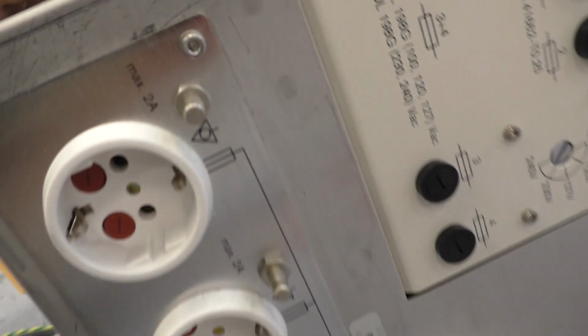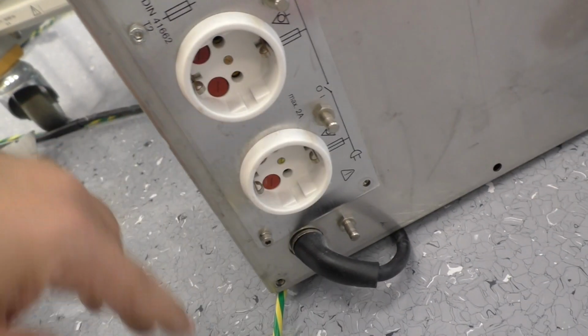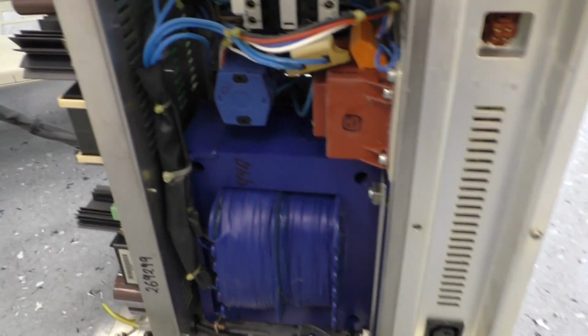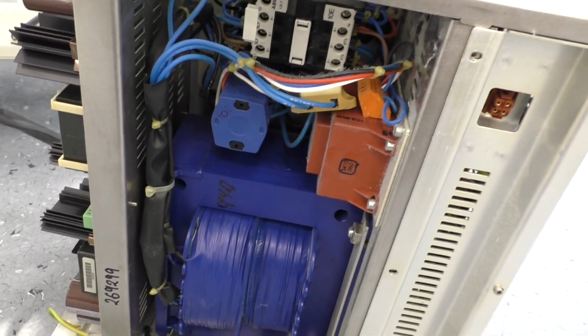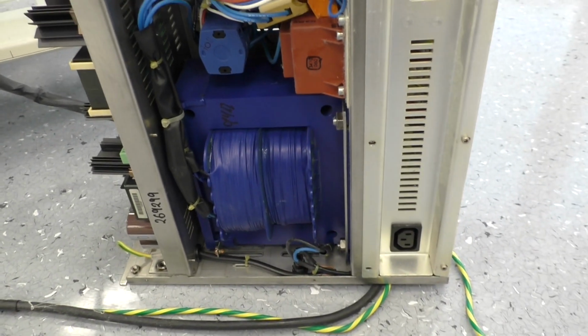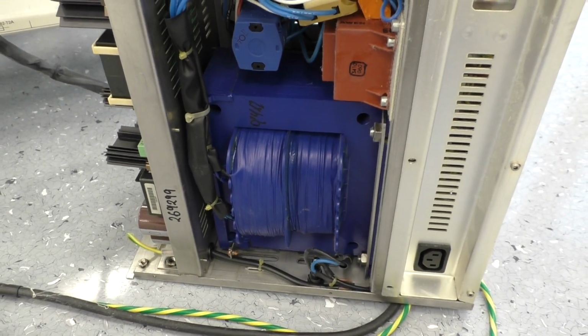So we have maximum 2 amps per socket, which makes 8 amps. That's about, well, maybe a 1 kilowatt transformer, or maybe a little bit more, something around that, a big relay, and a smaller transformer to provide some auxiliary voltages. Well, not that exciting, but a nice blue transformer.